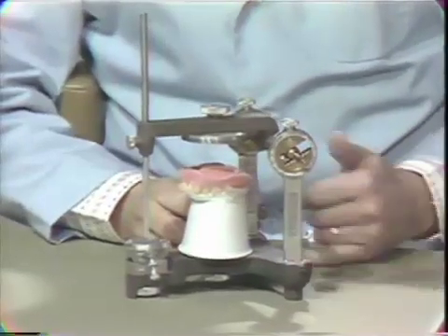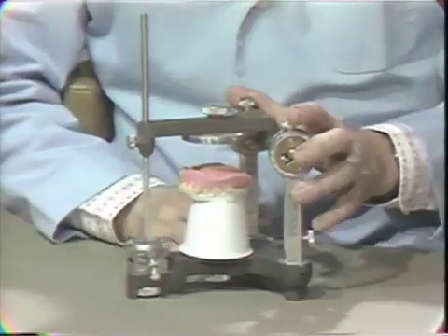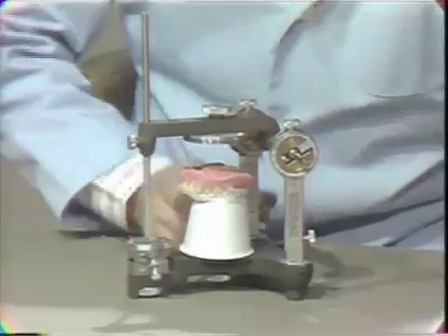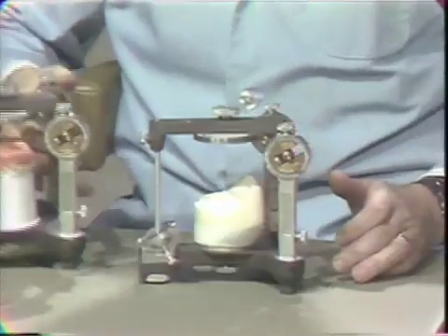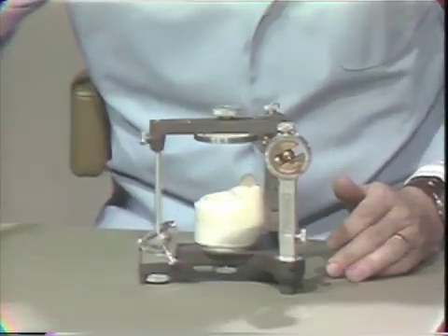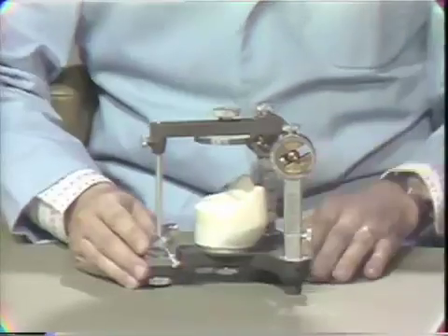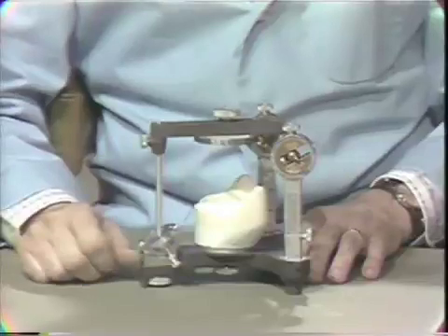Now everything that I have said deals with what we do clinically and I wanted you to be familiar with that next year when you work with your first patient. For our exercise we have some differences, and to make it more simple and less time consuming we're going to change the method a little bit — but understand that this is something we can't do clinically; it's just for this exercise.